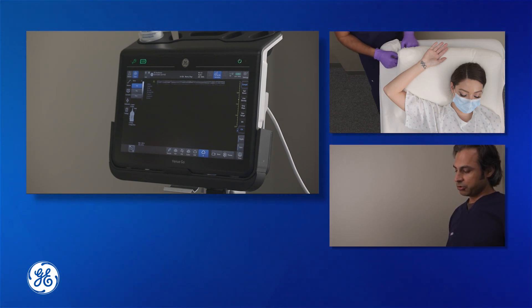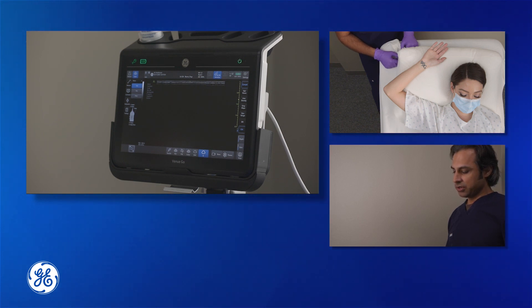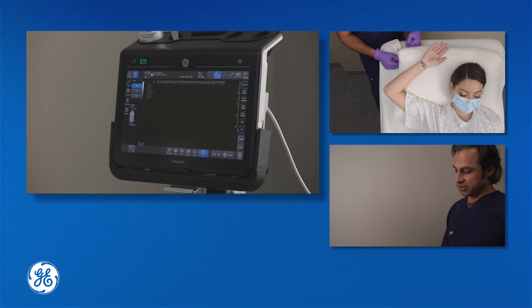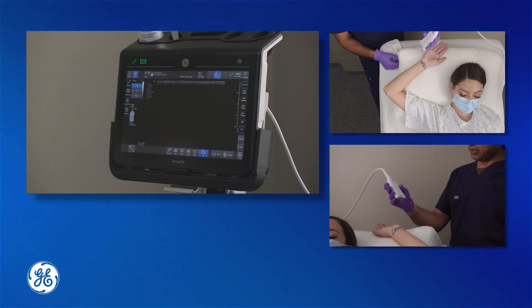This block can be performed traditionally as a landmark-guided approach underneath the flexor carpi ulnaris tendon. But sometimes this can be hard to visualize or palpate in certain patients. With an ultrasound, it becomes easy to identify the ulnar nerve. We'll start by looking at the ultrasound at the wrist.